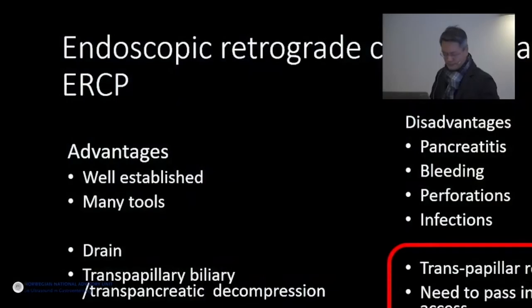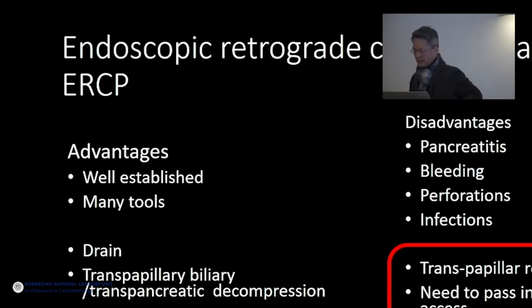Okay, so as you already probably know, ERCP is the main method to drain bile ducts. It is a very well known method, and it has a lot of advantages, but it requires that you pass instruments into the duodenum, and then you need to pass instruments through the papilla.